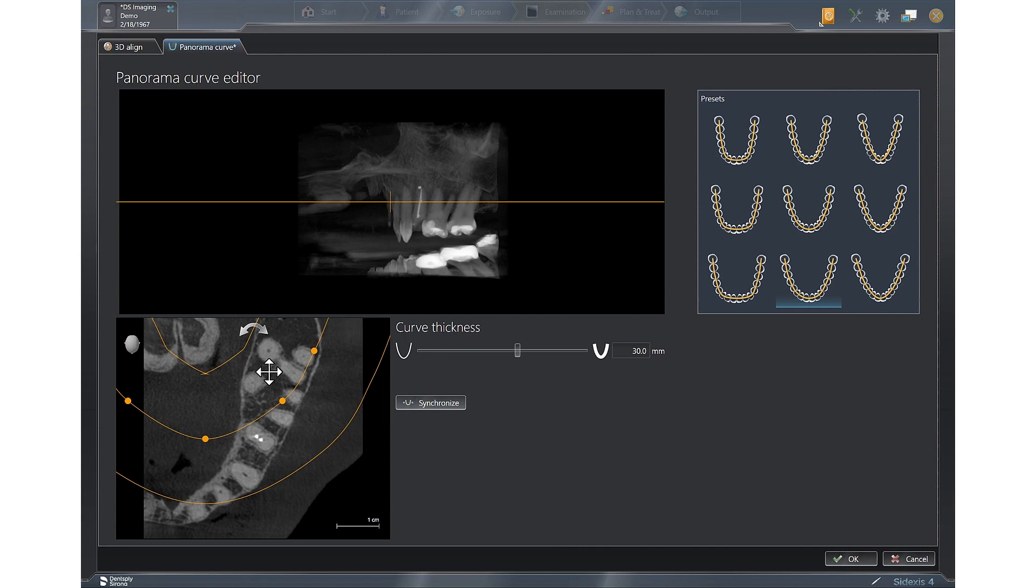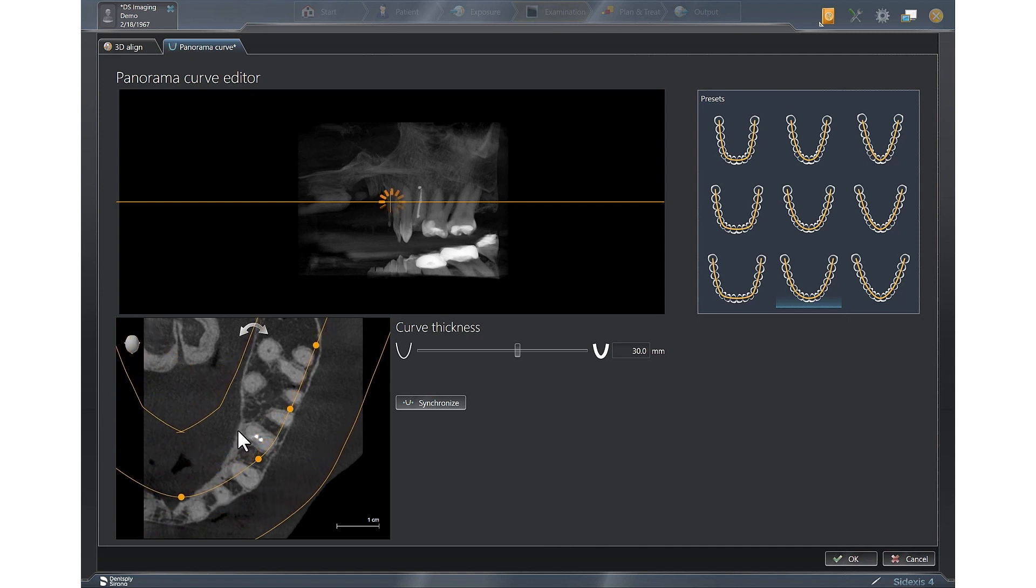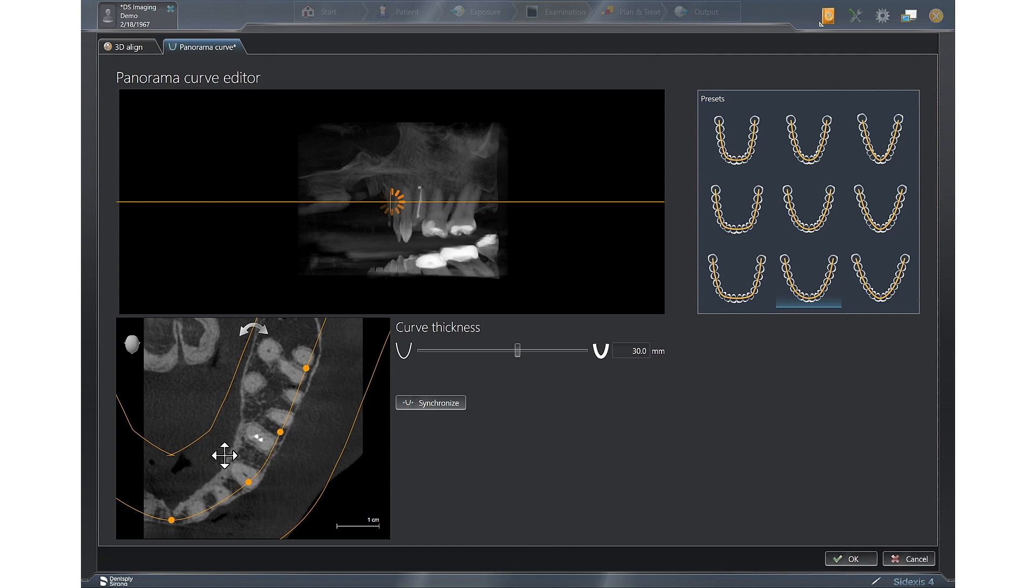The only other step you need to do to complete this for an upper arch, you're going to left click and drag the arch form down to visualize that the center dot on the upper arch is going between 8 and 9, whereas if it was a lower arch, you'd want that to go between 24 and 25.